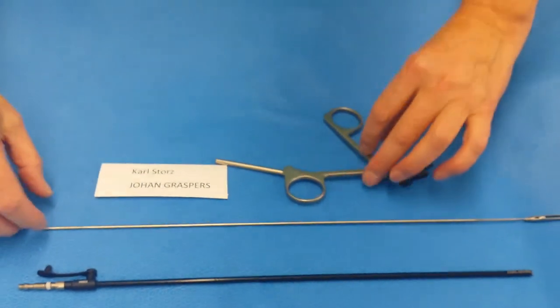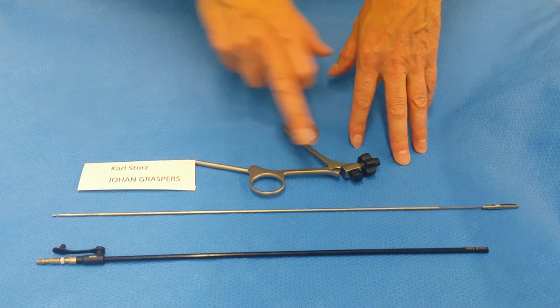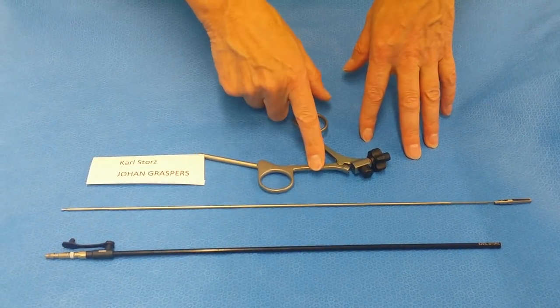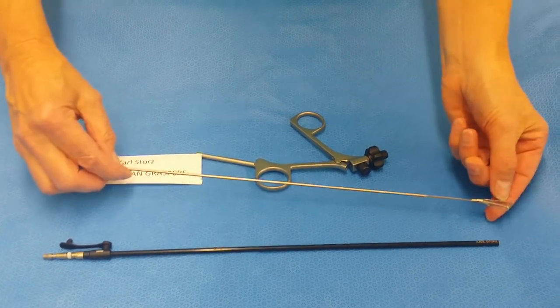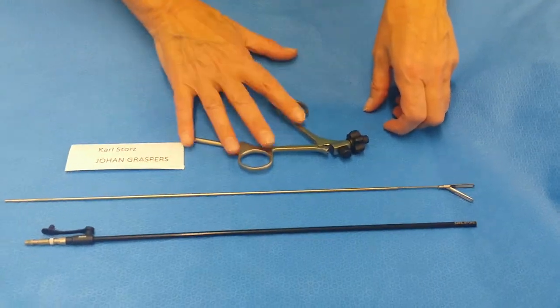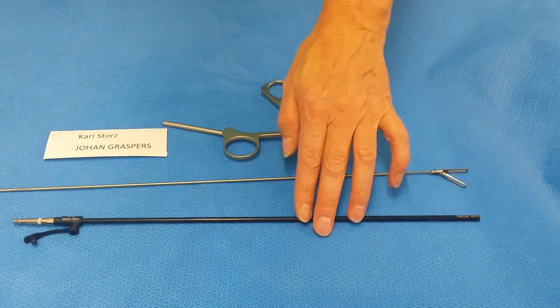How to assemble the Karl Storz laparoscopic Johan graspers, consisting of three pieces: a metal handle with a ratchet and non-diathermy, an insert which is a Johan insert, hence non-diathermy, a grasper, and a sheath that's insulated and has a rubber bung on it.